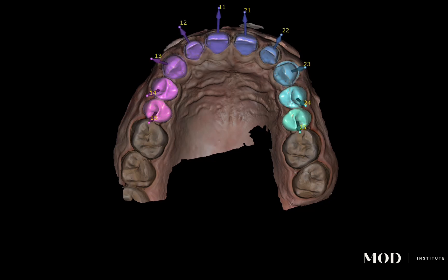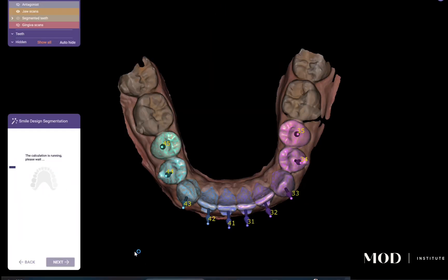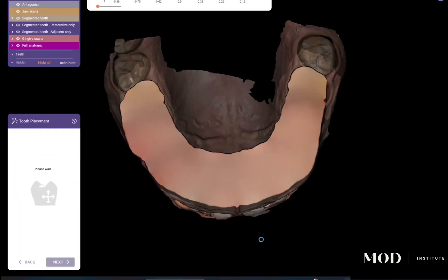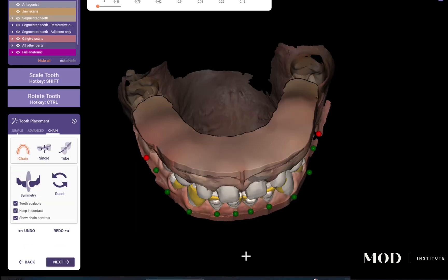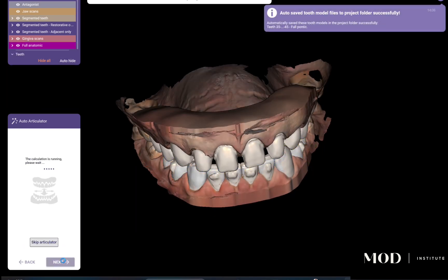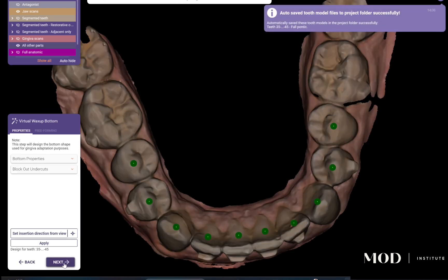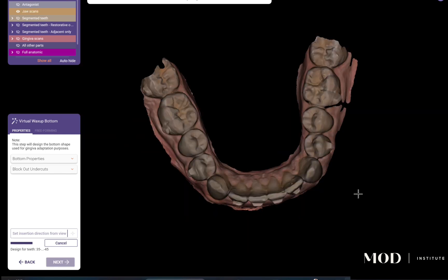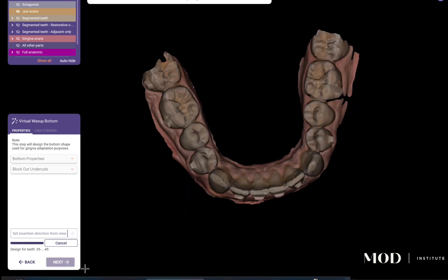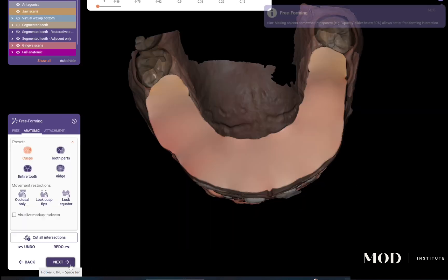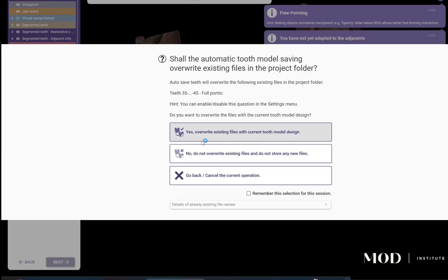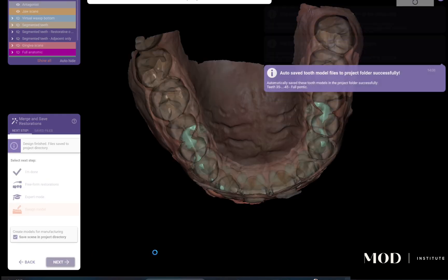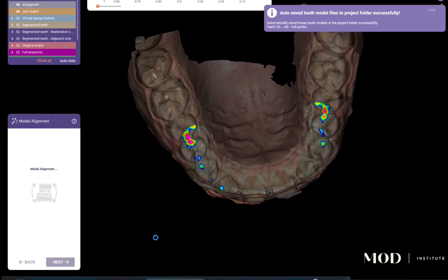I am not going to edit the segmentation even if it's not perfect — I'm just going to power through the wizard and get all the way to the end. I'll hit next, and once I get to the final merge part, I'll go to 'design model' and hit next.